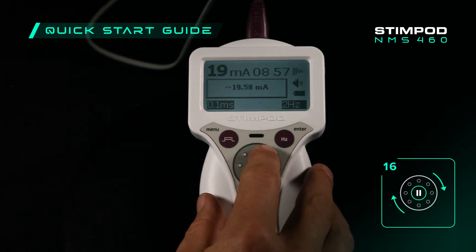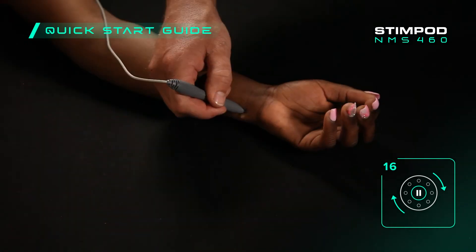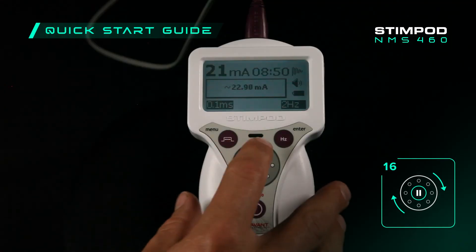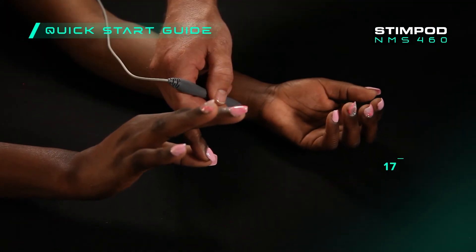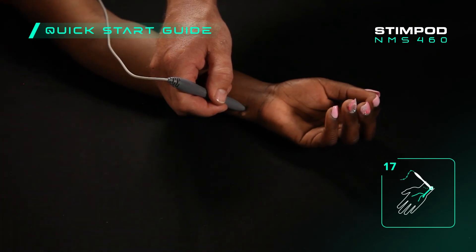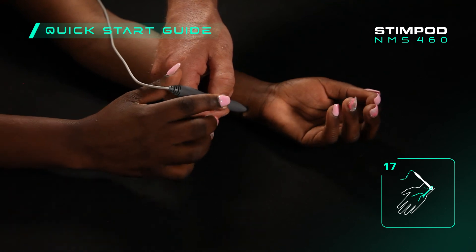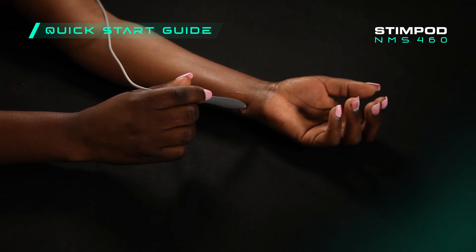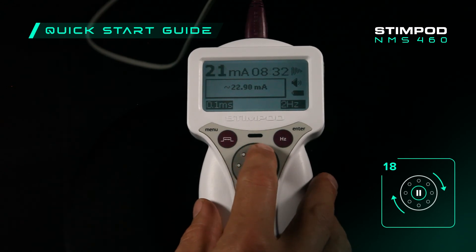This will confirm that you have located where the nerve is closest to the skin within the treatment site. Proceed to increase the current to the maximum level the patient can tolerate for the full duration of the treatment. An easy method to determine this level is asking the patient to tell you when the stimulation feels like a pinch, and then to turn the current back down to where the patient describes it as a tap. You can now keep the treatment probe on the stimulation site for between 5 and 10 minutes. If the patient is comfortable, they can even hold the treatment probe themselves. Once the nerve starts to accommodate to the stimulus and it is comfortable for the patient, you can slightly increase the intensity of the current again.